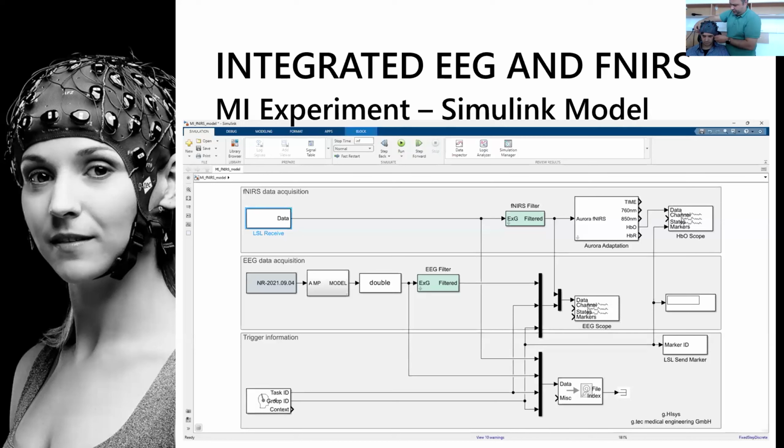It's very important that the CZ electrode is exactly in the middle of the distance between the nasion and the inion. So after years of experience, I can measure it like this. And also, it has to be on the center line in between the preauricular points.